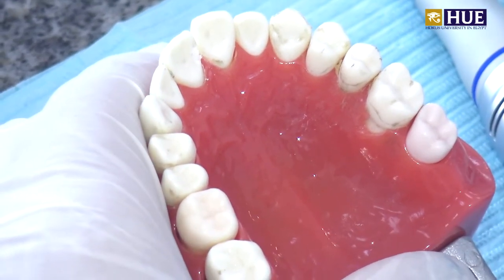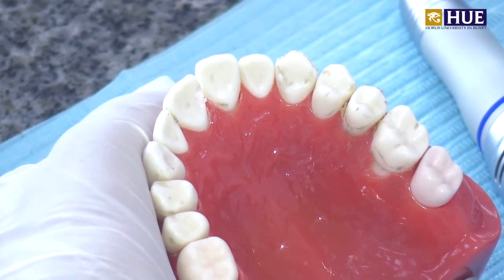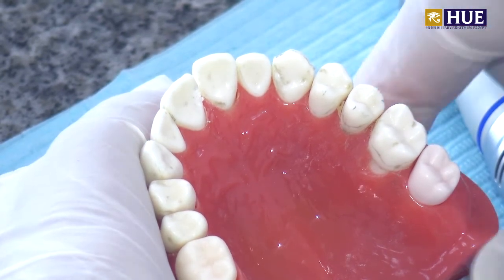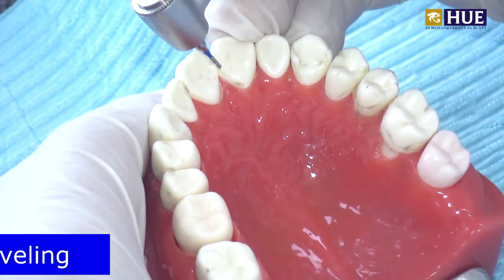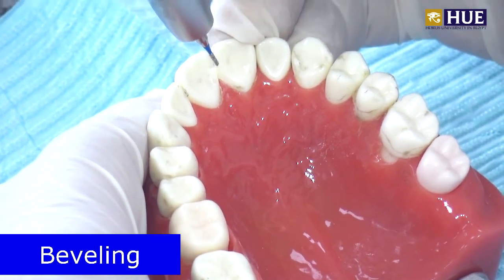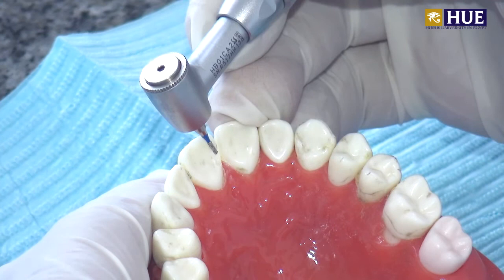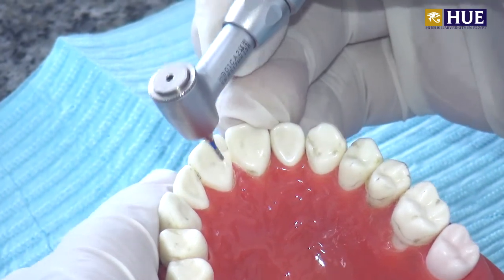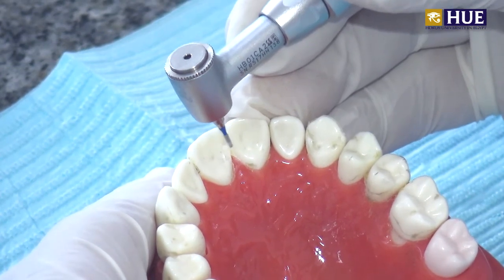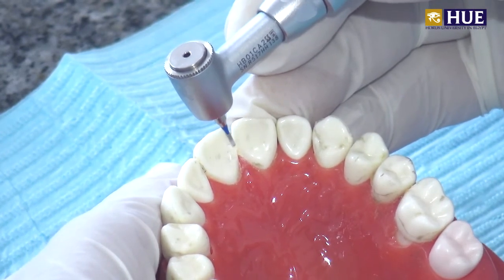This one needs a bevel, which comes after the GV Black design, and it is design number 2, called the beveled conventional design. At 45 degrees from the long axis of the tooth, we add a bevel starting from the incisal and going along the margins from incisal up to gingival like this, at 45 degrees using a flame-shaped diamond or round bur.